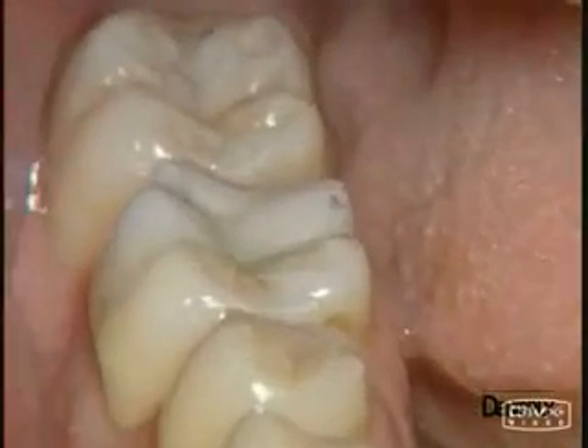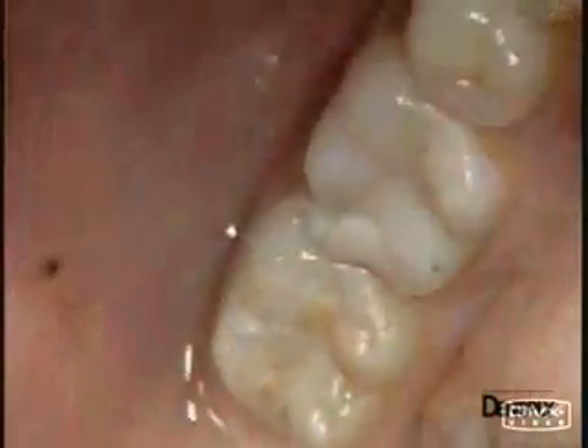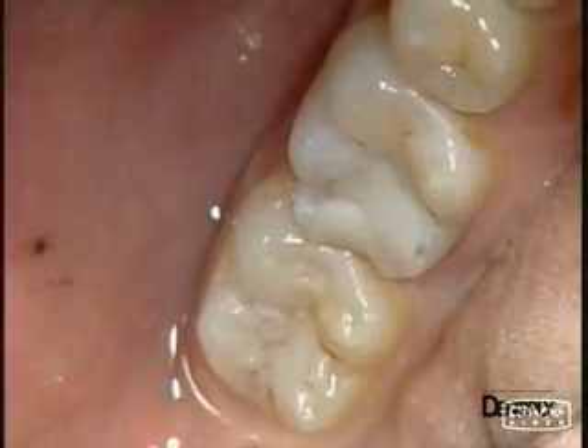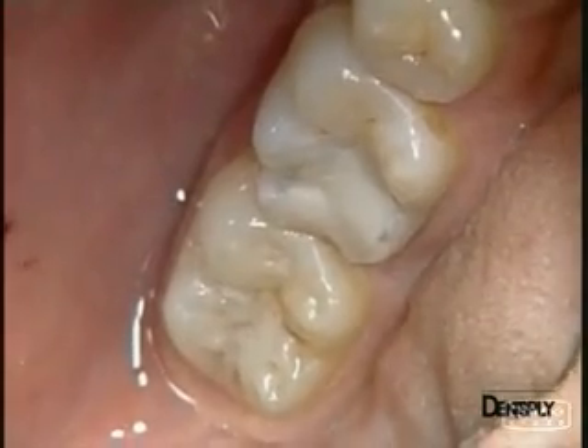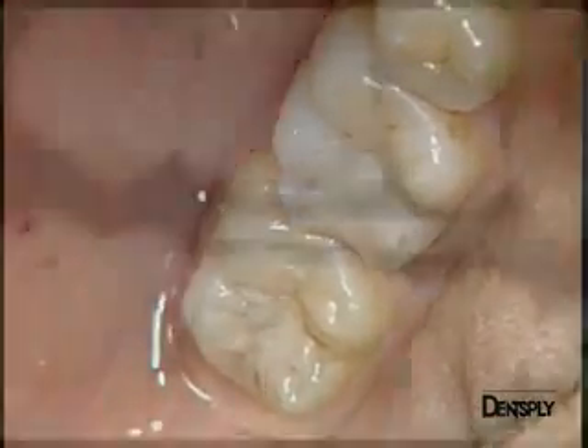The case of this patient, who presents very substantial composite resin on one molar, is at the limit of the indications for the direct technique. However, for financial reasons, this patient would prefer to avoid an indirect restoration.